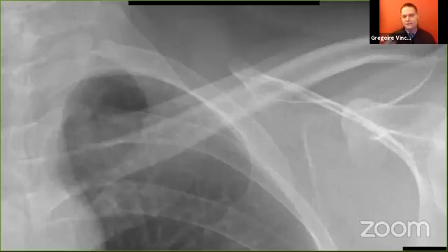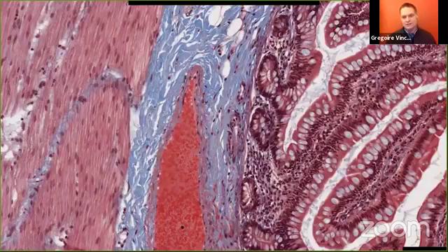And if you change the coloration, if it's a PAS, periodic acid-Schiff, you'll see some other components of the cells of the tissue and so on. So the samples must be prepared. And if in classical medical imaging and radiology you are working with shades of gray, digital pathology is definitely a full-colored world.